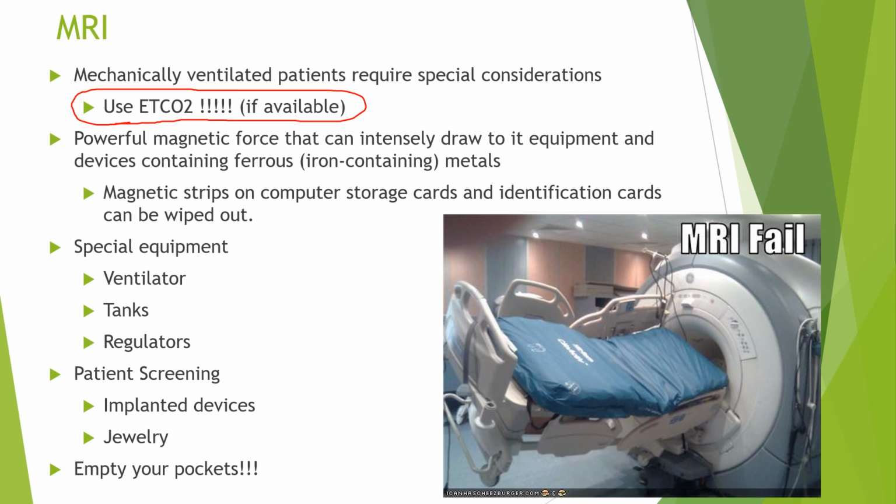Because with the MRI safe EKG during some of the scans, it goes crazy and gives you a weird reading. So you can't tell if the heart's still beating based upon the EKG. You could cycle a blood pressure, but if you cycle it every 5 to 10 minutes, that could be 5 to 10 minutes they were disconnected from the ventilator, especially if they have really poor lungs or heart hemodynamics. That could be detrimental. Heart rate is not something you can follow, and pulse ox is not something you can follow because it goes haywire with some of the imaging as well.